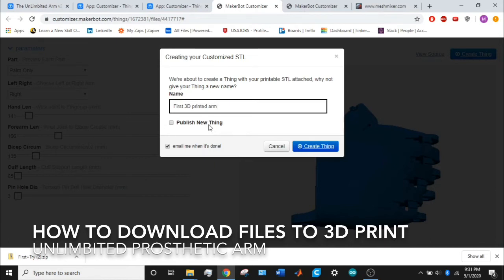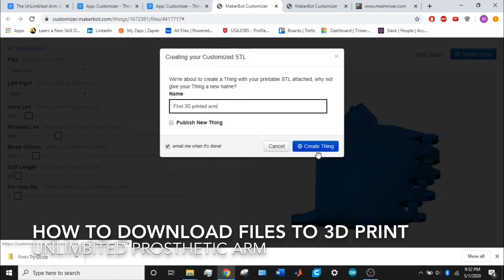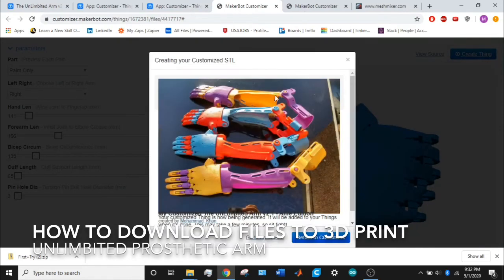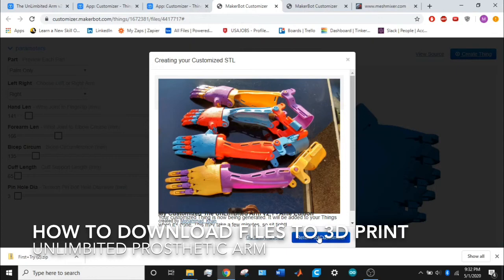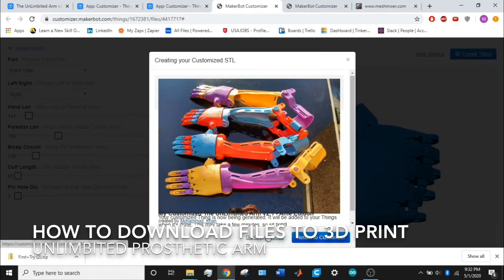This checkbox will have Thingiverse email you when the part is done printing. I check that box, then you just click create thing. Then they'll create your customized STL within 10 minutes, usually doesn't take that long. You can return to customizer to create your left arm or right arm. Same thing—create thing and it'll be good to go. If you click on this, it will take you to the queue.